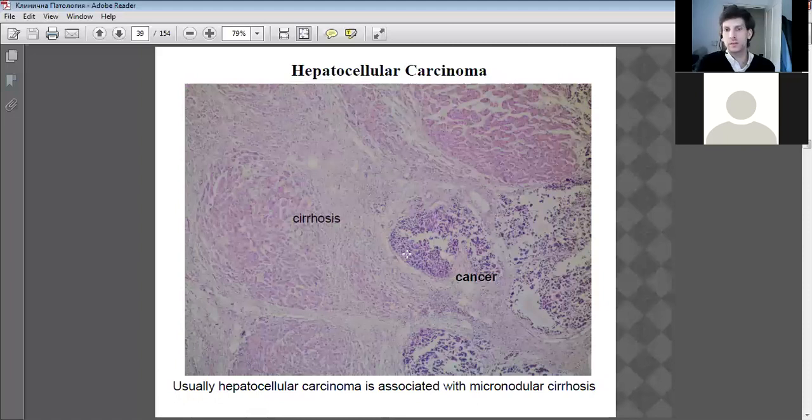Okay, and the cancer here is classic with the big spaces that have formed, hardened structure, fibrous tissue trying to surround it. The cirrhosis can lead to cancer, okay, if left untreated. So we saw before in the cirrhosis the loss of lobular function surrounded by lots of fibrous tissue, lack of a central vein, if you like.